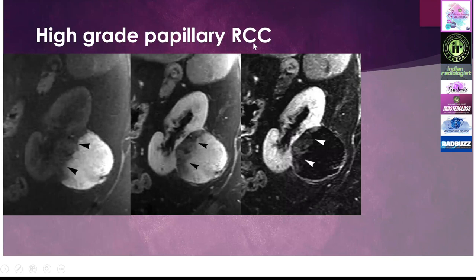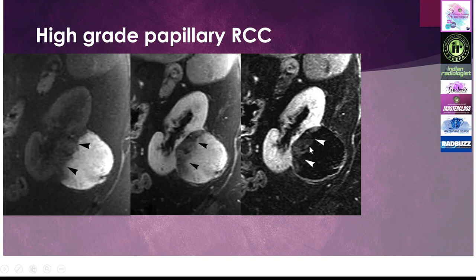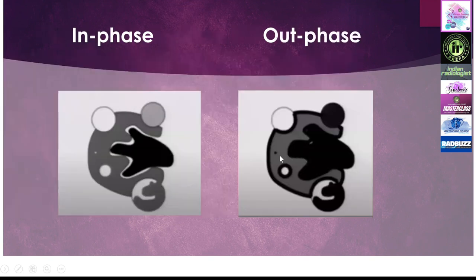This was a high-grade papillary renal cell carcinoma with extensive hemorrhage within the lesion. Without subtraction, we don't know whether this area is enhancing. On subtraction images, you can see a really ugly-looking papillary renal cell carcinoma, which can be easily diagnosed once we subtract the hemorrhage. Subtraction is very important for diagnosing tumors.